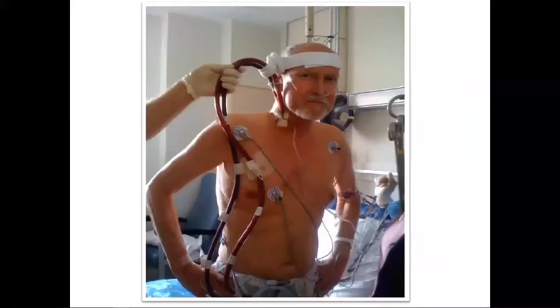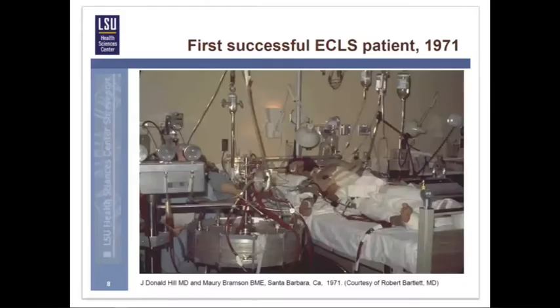And as a technology, it's very good for changing saturations. And you'll see many pictures of patients walking around on ECMO. This has not been our experience of how sick these patients are, where oxygen consumption is the primary problem. But when it comes down to CO2 clearance, it's actually quite effective, and you can sometimes mobilize your patients on ECMO. They don't show you the 15 people in the background making sure that this doesn't fall out while the patient mobilizes.